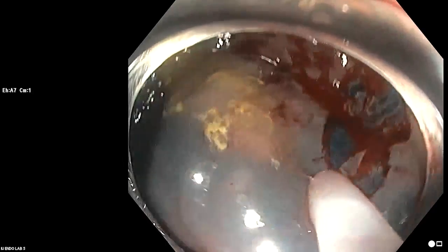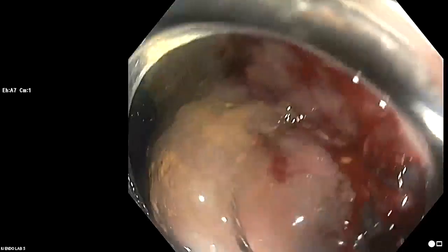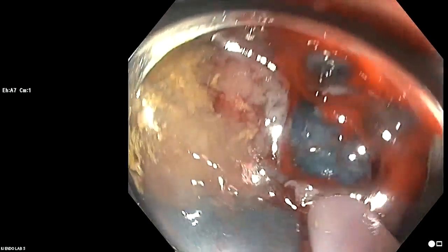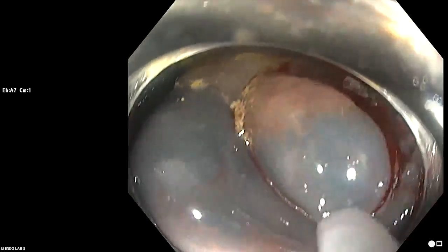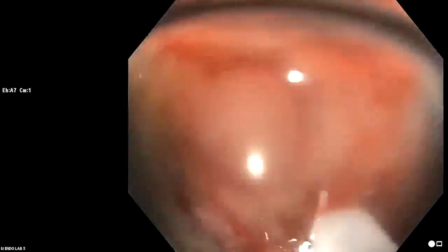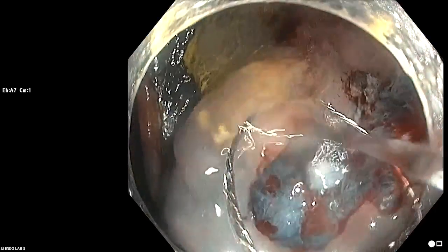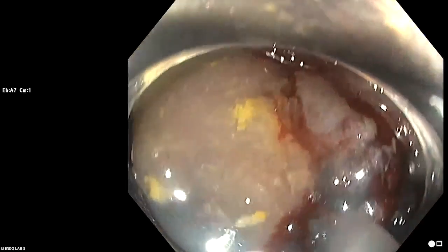And obviously the other factor that's really nice about cold resection, I will say that the recurrence rate after cold resection of SSLs across the literature has been really low. The highest one I saw was really from our center. Now that may be because we don't bring these patients back generally in 6 months, close and cut. I bring back really big adenomas in 6 months if we did a piecemeal EMR. But these lesions grow back very slowly, and I think they're low-risk lesions. A lot of people think, close and cut, that serrated lesions are high-risk lesions for cancer. And if you actually look at the prevalence of cancer in serrated lesions according to their size, it's about 1/7 that of adenomas. Close and cut, John.